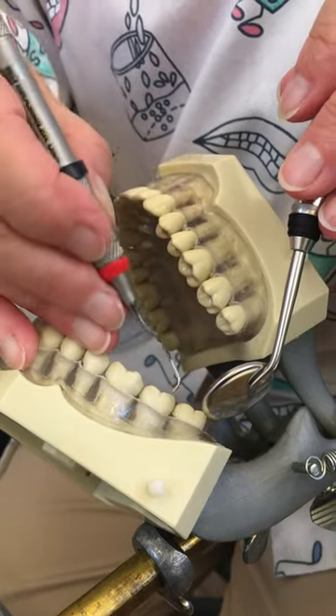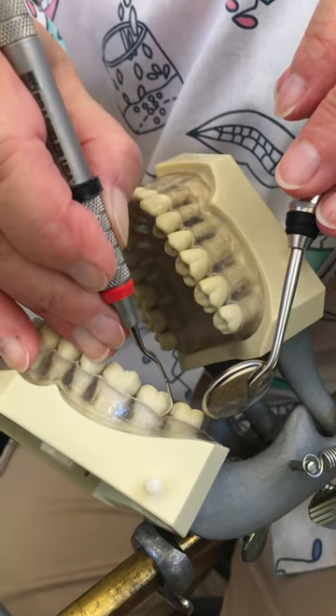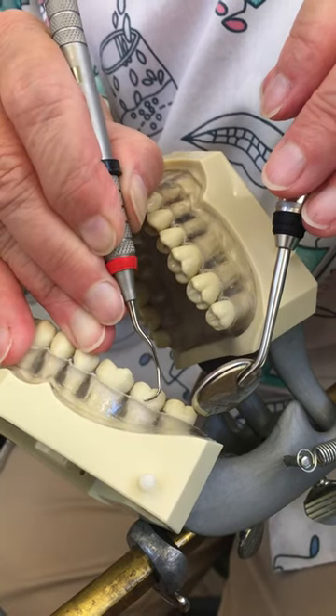When I finish, I'm going to stop, go to the next tooth, insert closed and explore, and then open once I find the debris and I've gotten underneath it.